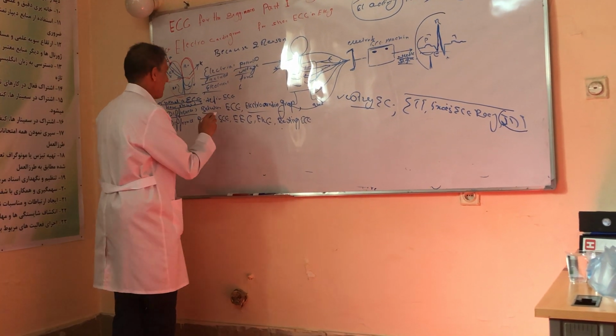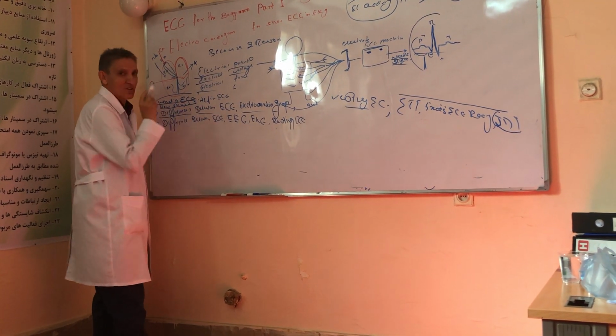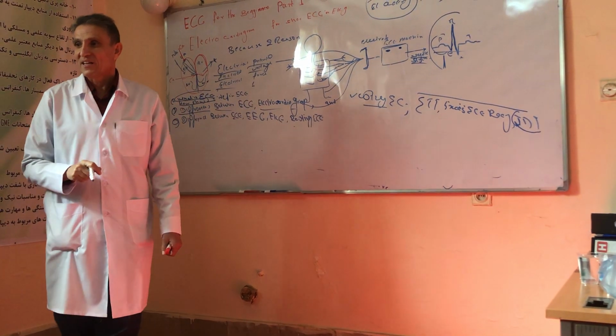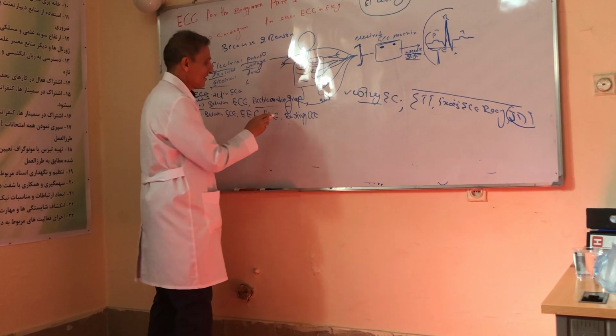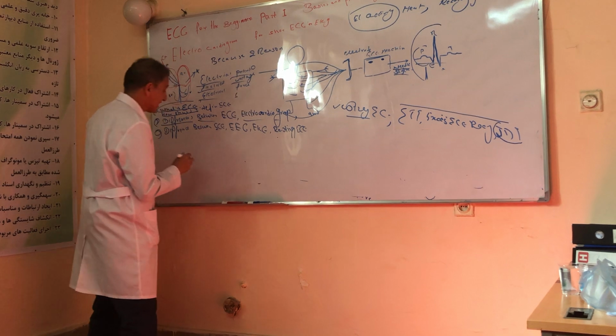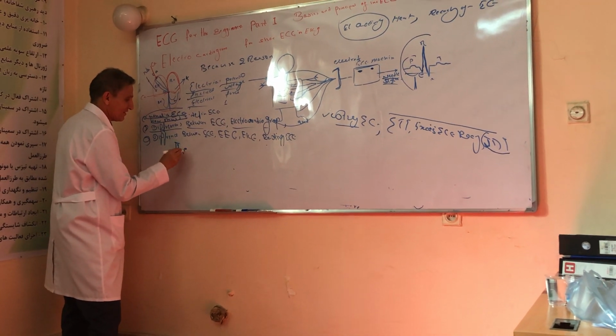This was about the electrocardiography. Electrocardiography represents those instruments which are used for recording of electrical activity of the heart. Another term, the ECG graph. This is a little bit tricky.